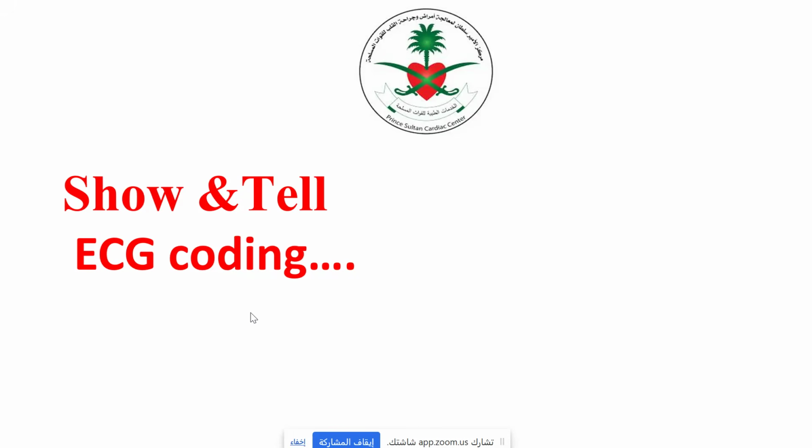Without any further ado, in this presentation, we will explore some critical rules of the ECG in recognition of arrhythmia in the form of tachyarrhythmia or bradyarrhythmia. As you know, the ECG remains the most valuable non-invasive tool in cardiology. So let us begin our journey into the heart rhythm through the lens of the ECG.